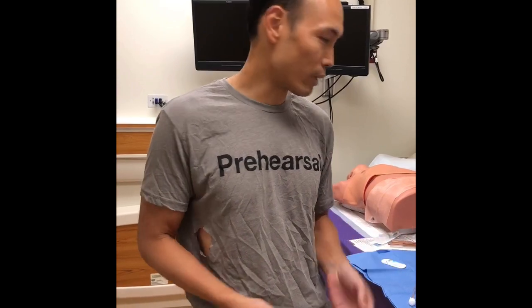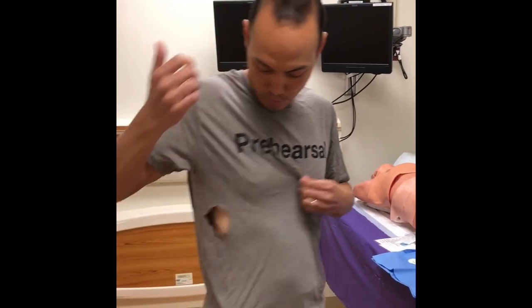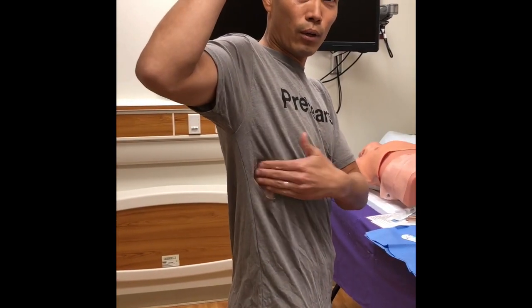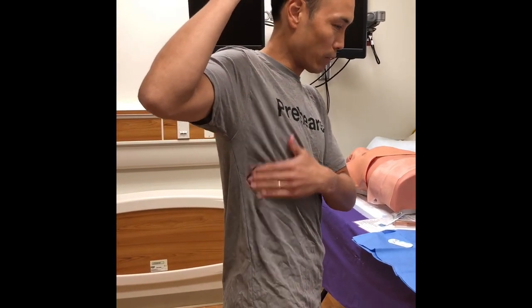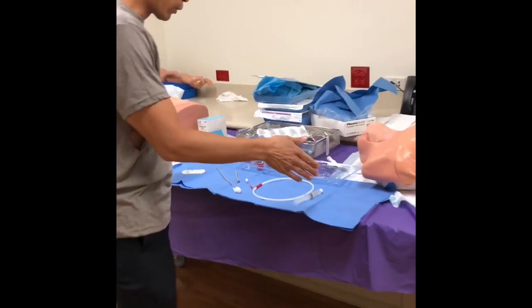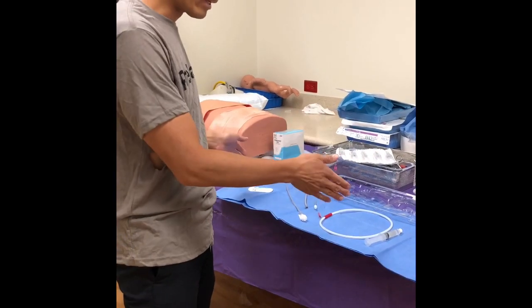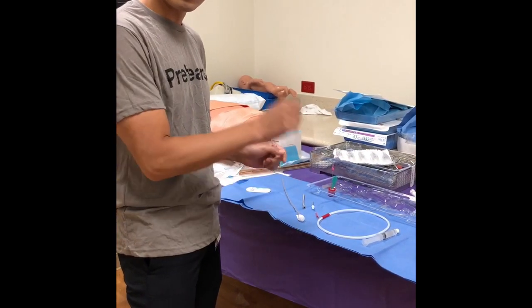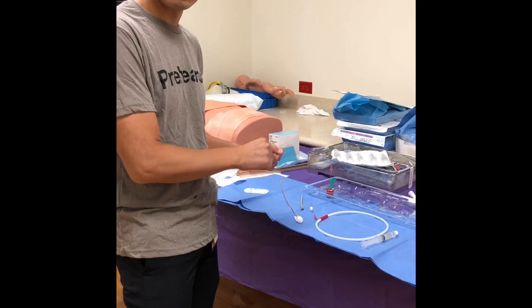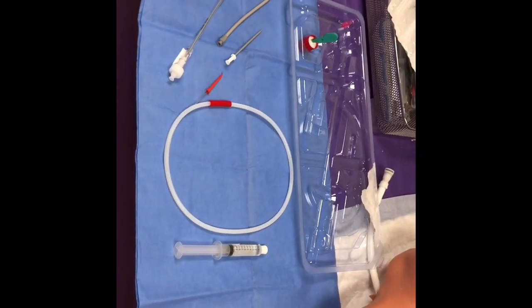We're going to show you this concept on a chest tube today. In order to get in the mood, if you need to know where to go, you can mark yourself up. We're going to do a quick chest tube, and the most important thing is to prepare your equipment. I like to line the tools up in the order I'm going to use them.